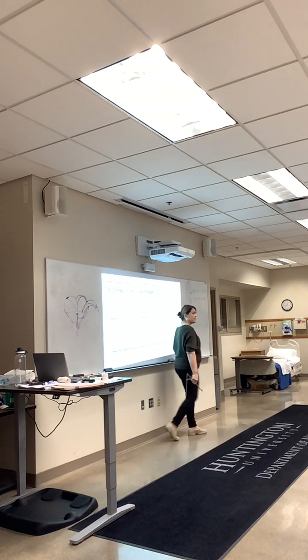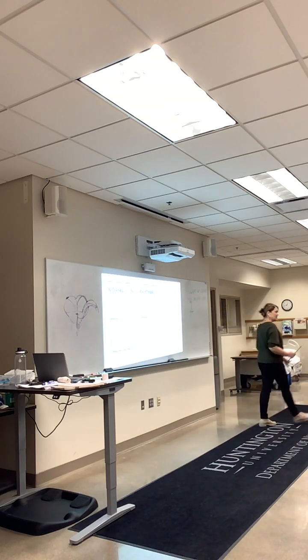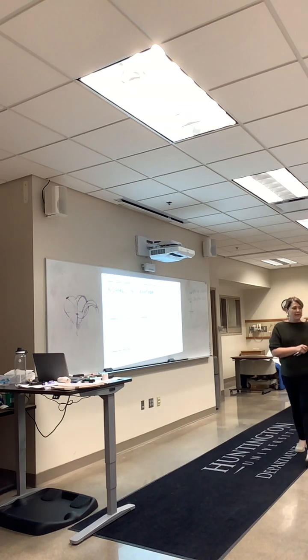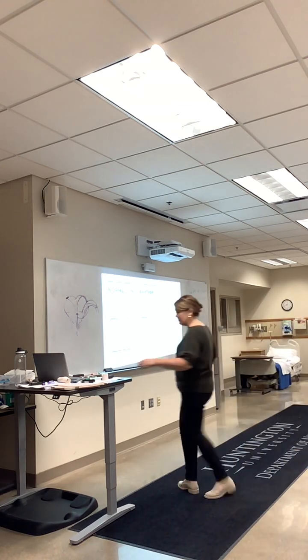That gives me a regular rhythm. If some were this distance, some this, some this, those are different distances, and that's called an irregular rhythm. When you palpated their pulse, it'd be like dun dun dun dun dun. It'll make you feel weird, like your own heart can't beat right because it's off rhythm. And so we're looking for that.